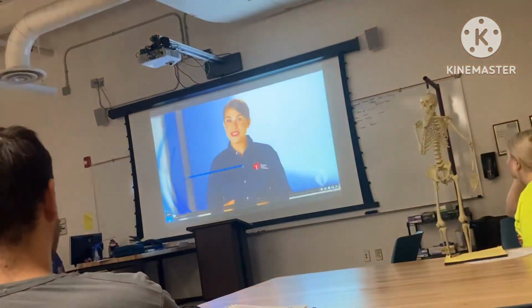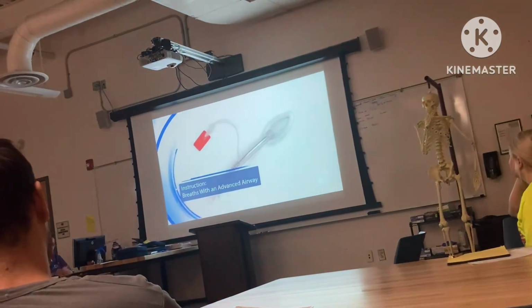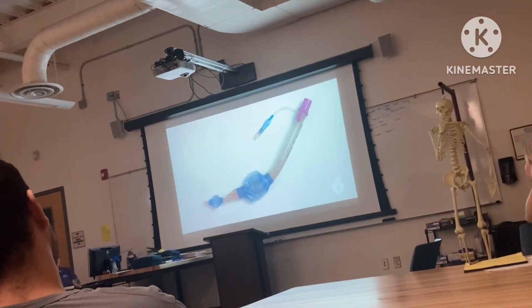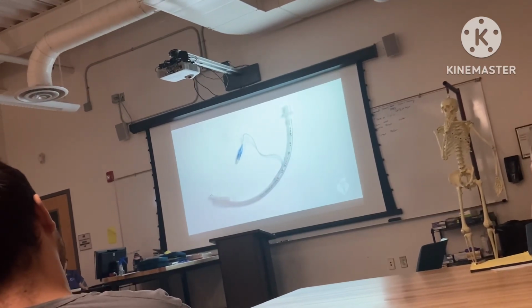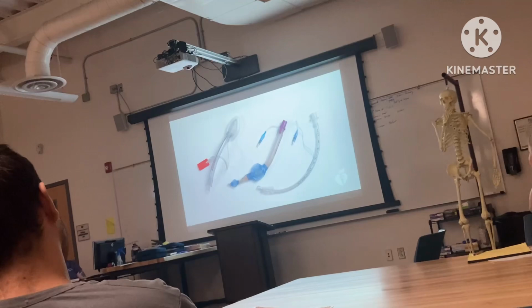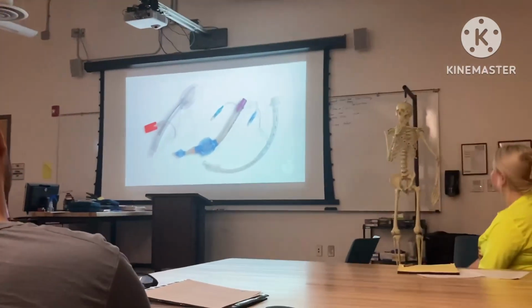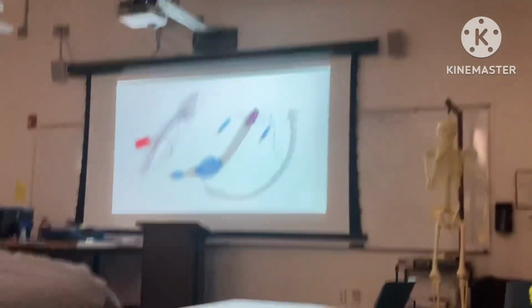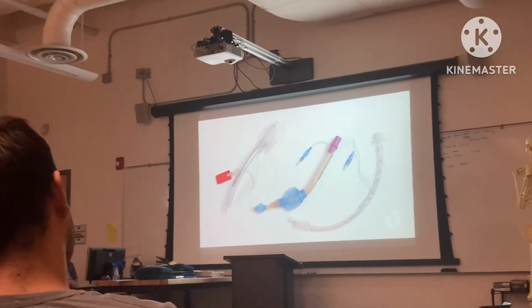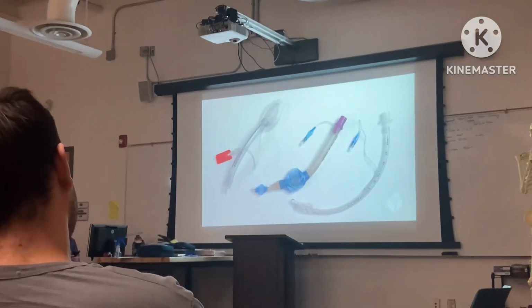access. Another way to deliver breaths is with an advanced airway. Devices such as laryngeal mask airways, supraglottic airway devices, and endotracheal tubes are types of advanced airways that are more secure for providing breaths. These devices help prevent gastric inflation and airway obstruction. Placing these devices requires special training that we won't cover in this course, but you should know how to give breaths when an advanced airway is in place.